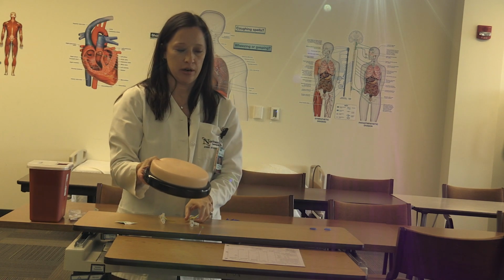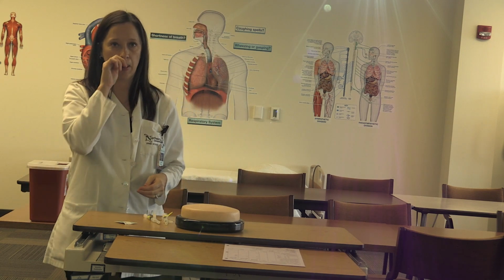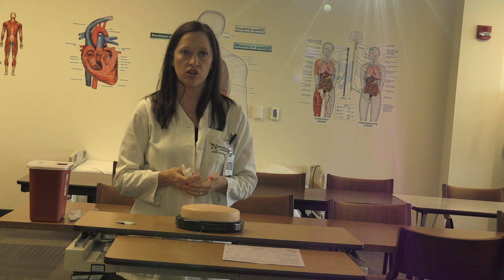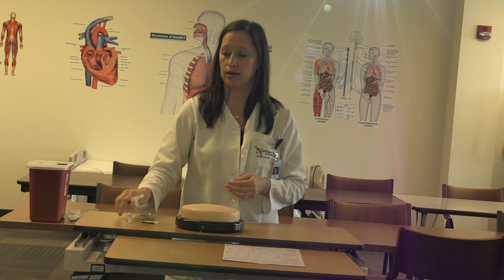Handy dandy patient here. So now I'm going to walk into the patient's room. I'm going to introduce myself. I'm going to do the normal patient identifiers. I'm going to ask them, can you tell me your name, your date of birth, and I'm comparing that with their bracelet, and it should match. I'm going to do hand hygiene, and I'm going to get my gloves on.